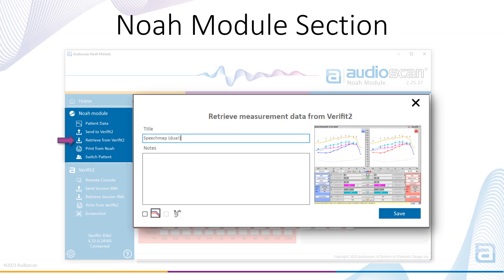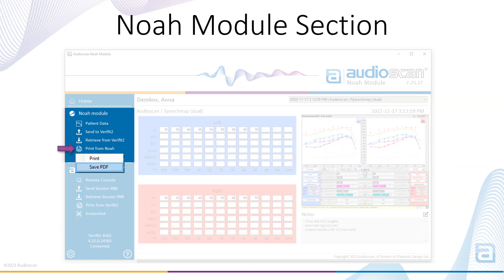Select Retrieve from Verifit 2 to pull measurement results, audiogram data, and RECD data into the AudioScan NOAA module. Selecting Print from NOAA enables you to print an AudioScan NOAA module generated report. This will include any audiometric data and measured result data associated with the selected patient. A hard copy or PDF can be printed.